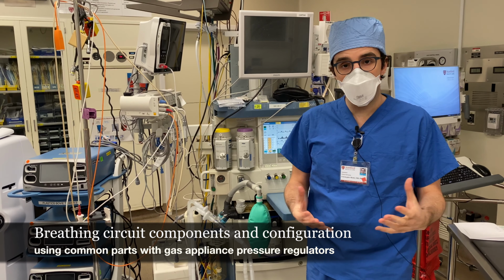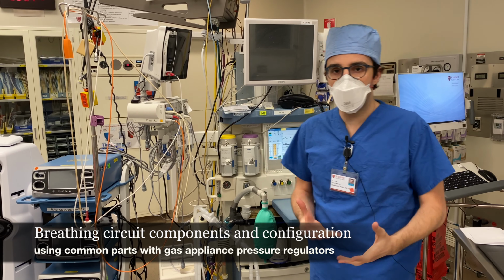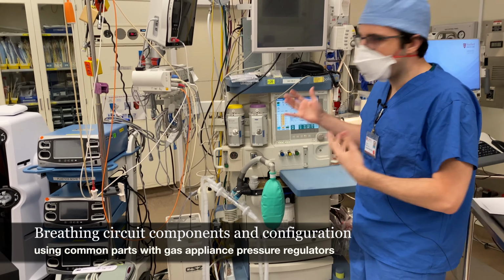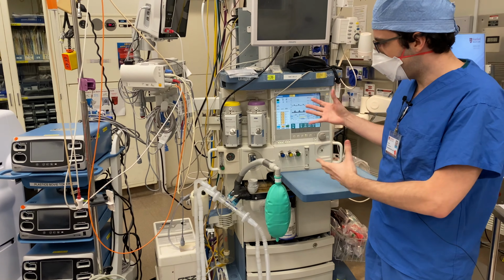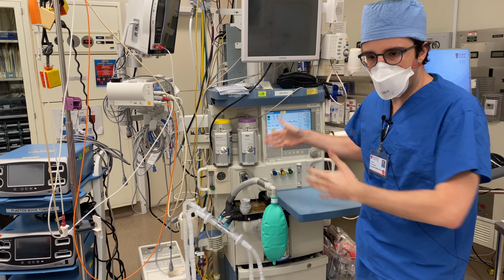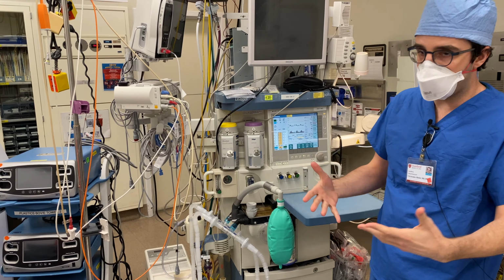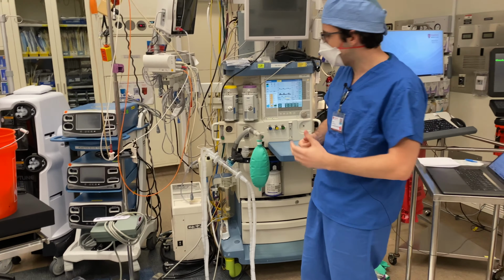Okay, so now I'll give you a brief overview of the design that we've come up with to try and achieve these goals. So what we have here is a standard anesthesia machine, which includes a ventilator as a part of it. And I'll just walk you through from the anesthesia machine or the ventilator all the way through all the components to our two simulated patients.